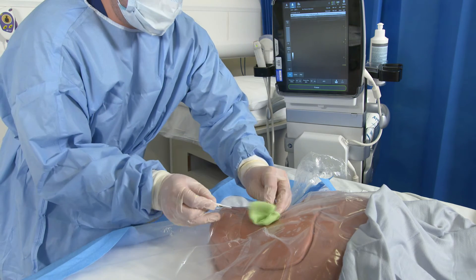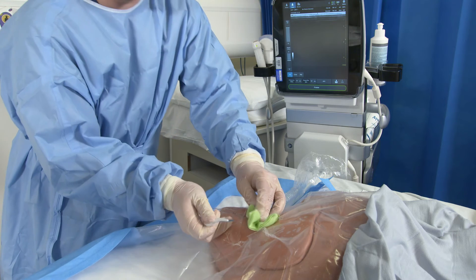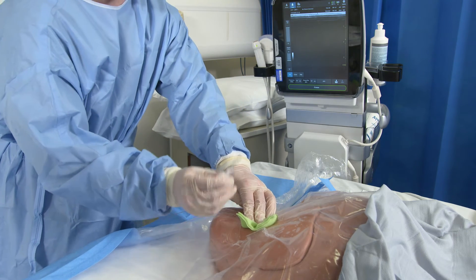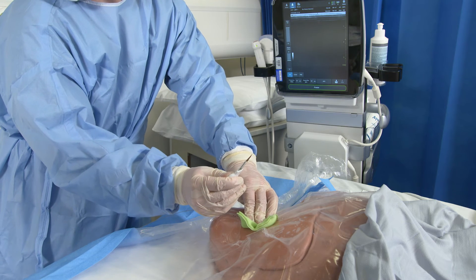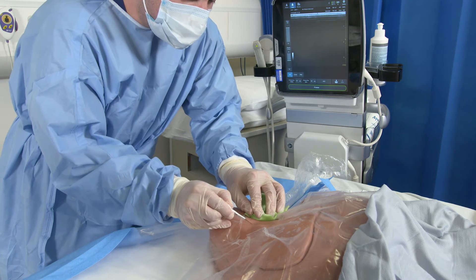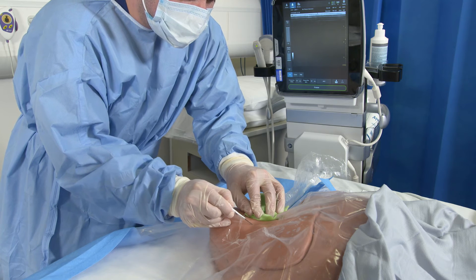The next step is to make a small incision in the skin in order to allow your dilator and ultimately your line to go in easily. There's a small scalpel contained within the CVC kit. Use this along the path of the guide wire to make a small incision in the skin.